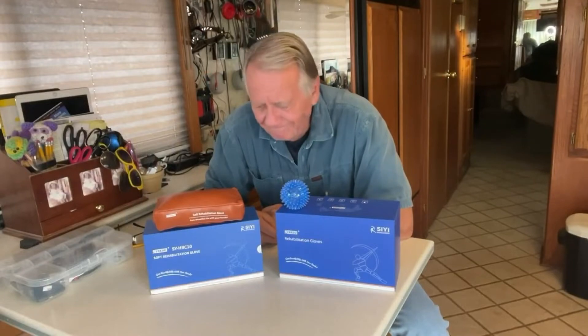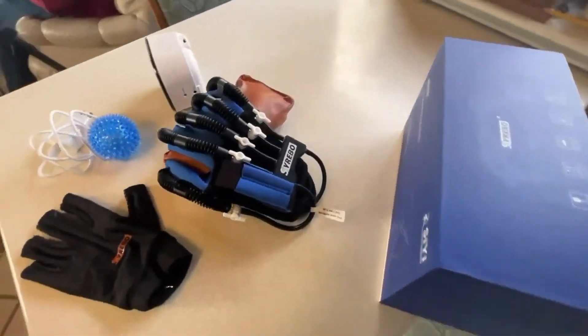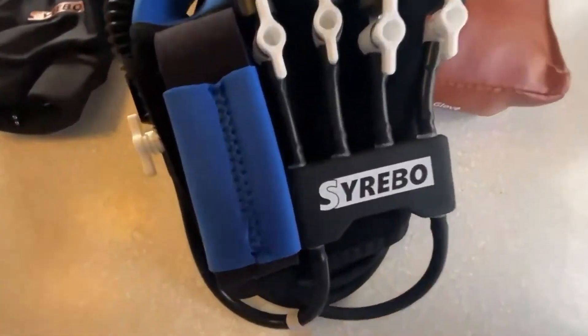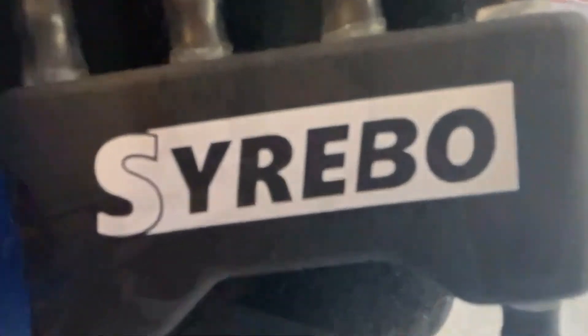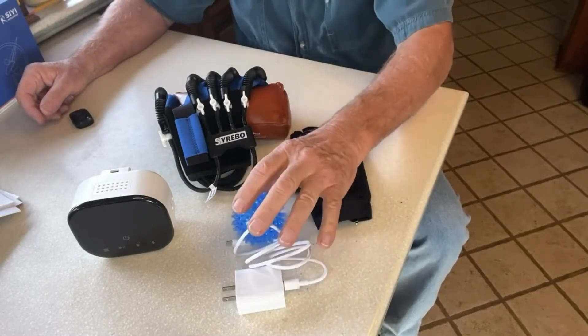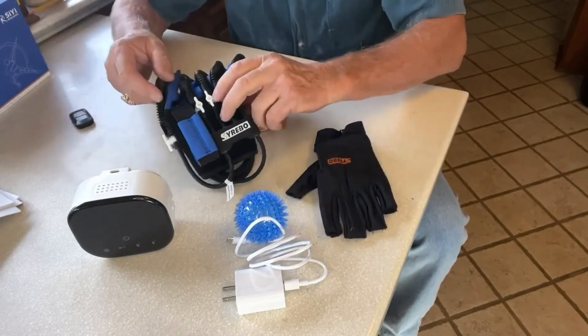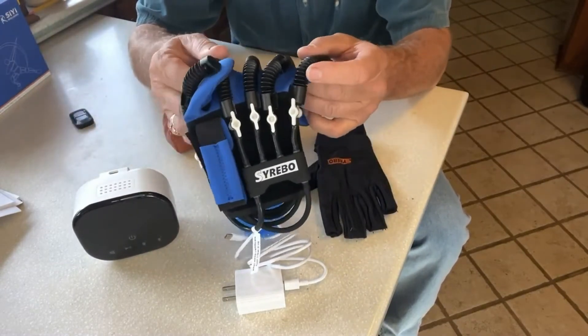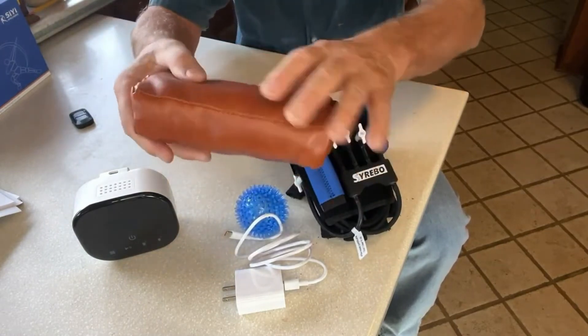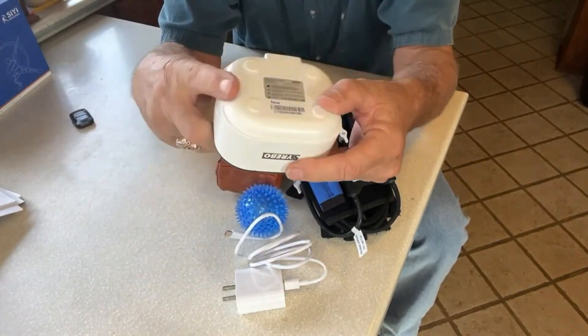Let's take a look at this magic glove. This is the nice packaging it comes in — let's unpack it. Here's what we got: we have the power cable, an exercise ball, this is called the data glove, the robotic glove, the exercise cushion, and what they call the host, which is the brains that makes it all work.